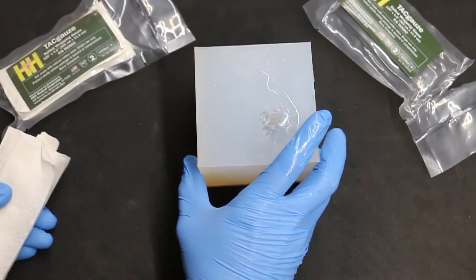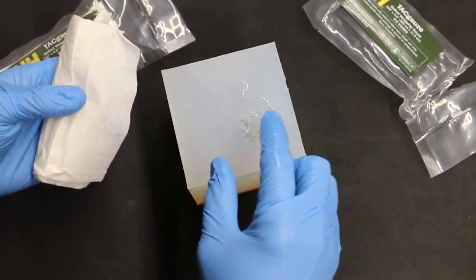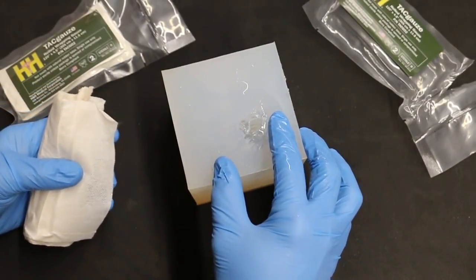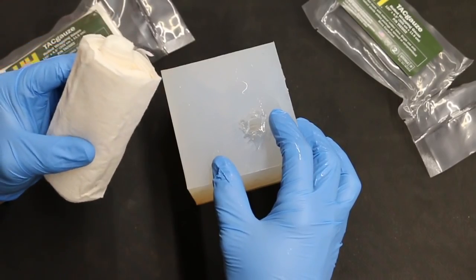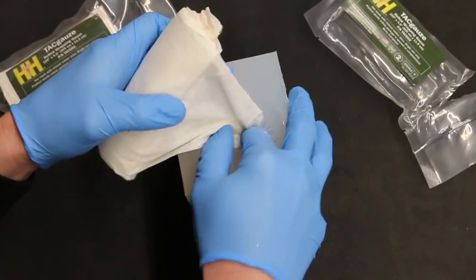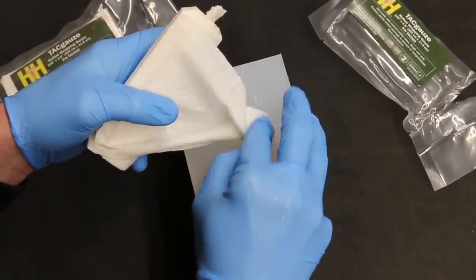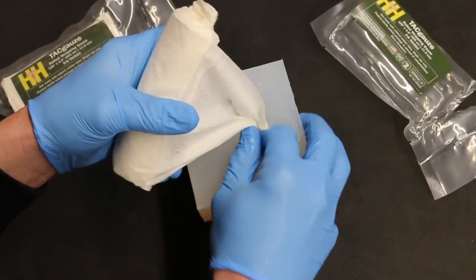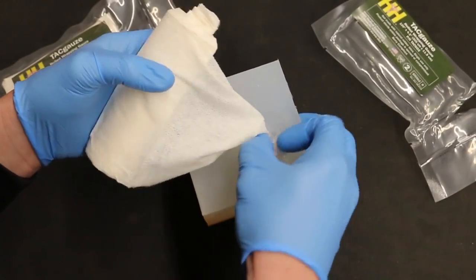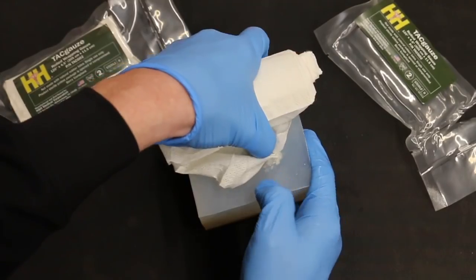We're going to use the Focus Research Group wound cube as our demonstration model. We've got a gunshot wound here in a junctional area that we cannot get a tourniquet to, so we'll use gauze to pack it. Take a good bit and just start running it down in there, getting it as far down to the source as possible, until we've got as much packed into the wound cube as possible.